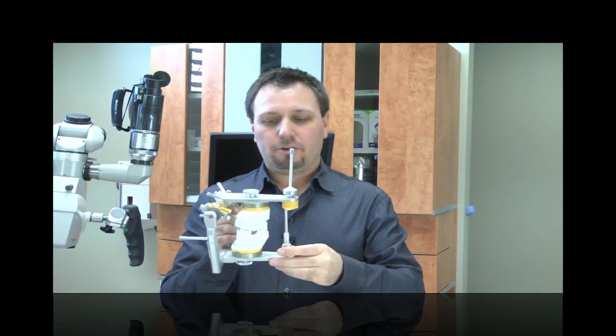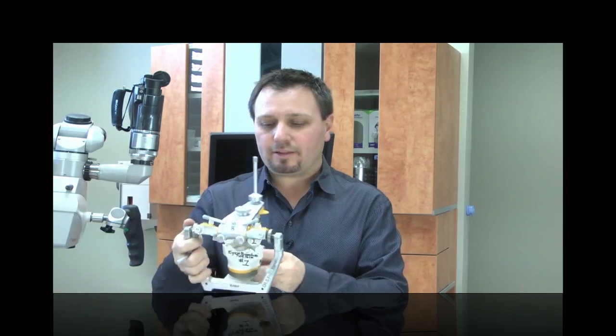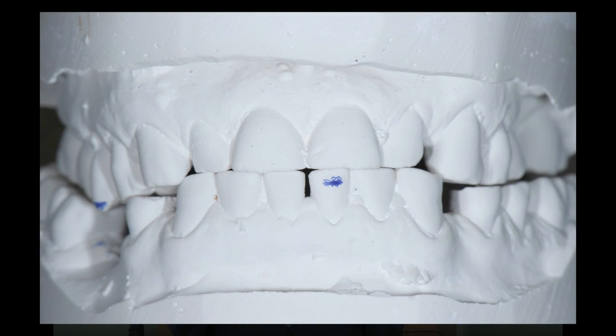And so basically I did all the diagnostic records that I do on cases like this. Here's the actual diagnostic records on the articulator mounted, and the case is in fact end-to-end with a posterior crossbite. And we looked at the case in quite a bit of detail, and I actually sent a set of the diagnostic models to my ceramist, Mr. Harold Heindel, who's a master dental ceramist.